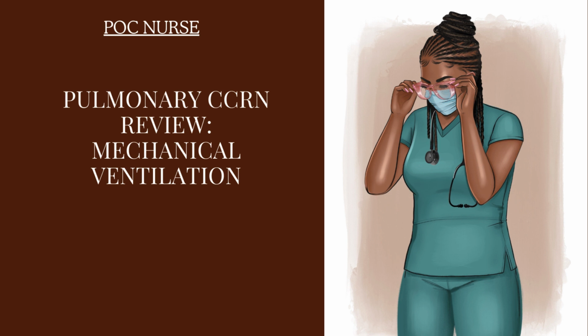So when do patients generally get mechanically ventilated? I came up with 4 reasons. 1, when they can't ventilate, meaning they cannot move air in and out of their lungs. 2, when they can't oxygenate, meaning that they cannot adequately exchange gas at the alveoli capillary level. 3, they cannot protect their airways. And 4, their airway is obstructed or at risk of becoming obstructed.